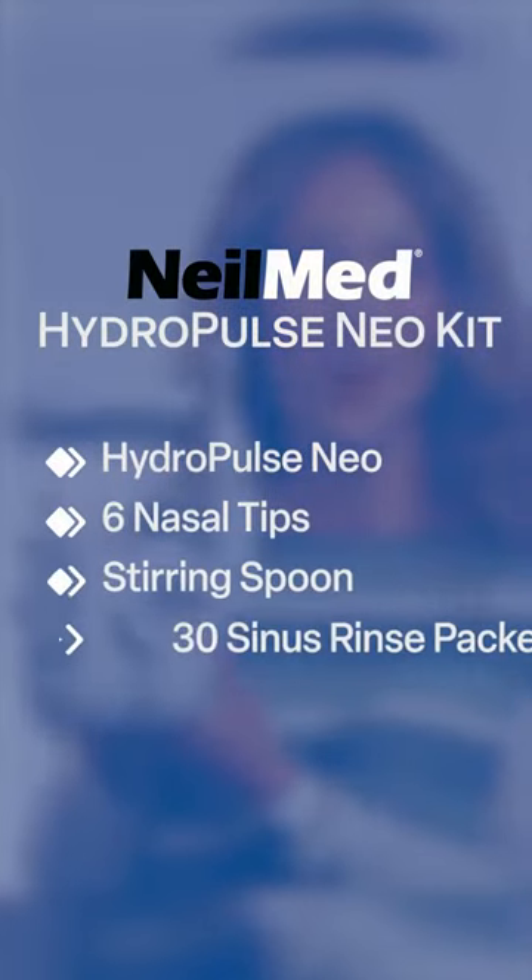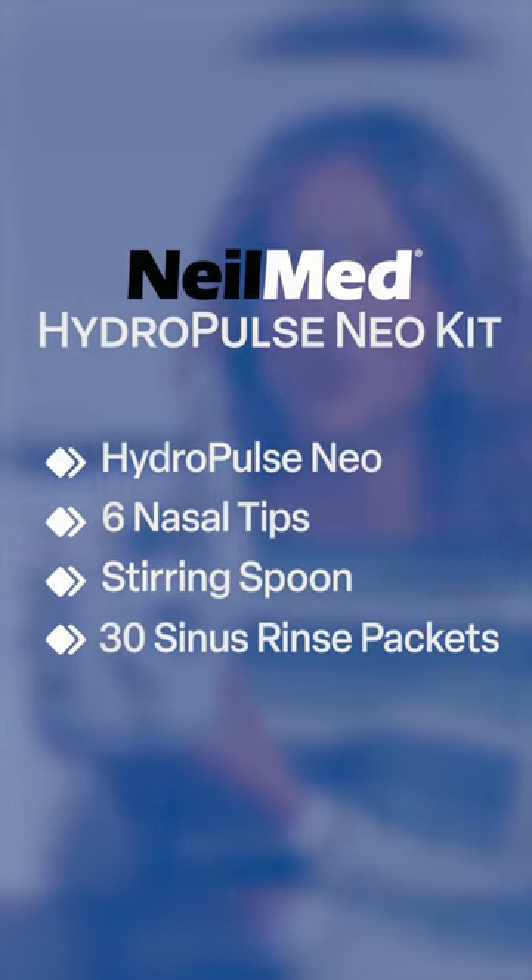The kit comes with one HydroPulse Neo, six nasal tips, a stirring spoon, and 30 pre-mixed packets of NealMed sinus rinse.